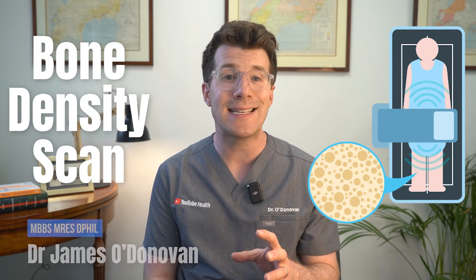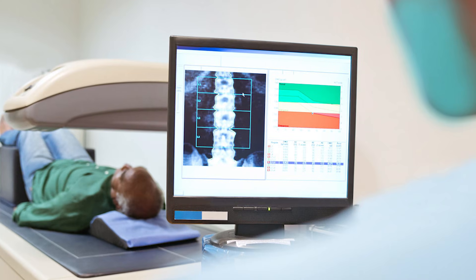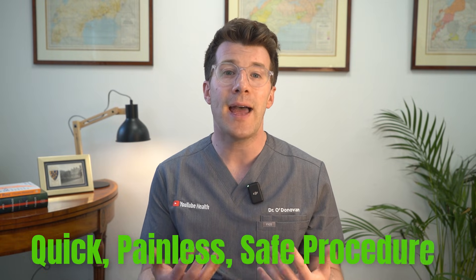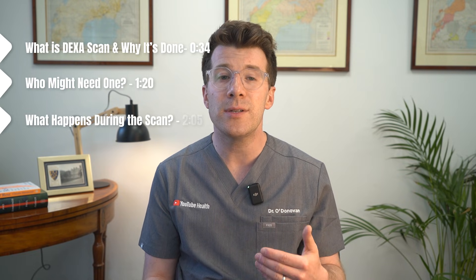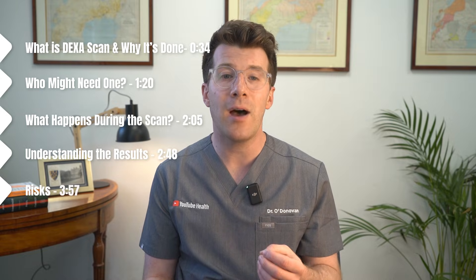My name is Dr. O'Donovan. If your doctor has recommended a bone density scan, or you're curious about what it involves, then this video is here to help. A bone density scan, also known as a DEXA scan, uses low dose x-rays to measure how dense or strong your bones are. It is a quick, painless and very safe procedure that helps to identify your risk of osteoporosis. In this video we're going to cover what a DEXA scan is and why it's done, who might need one, what happens during the scan, understanding the results, and whether there are any risks.